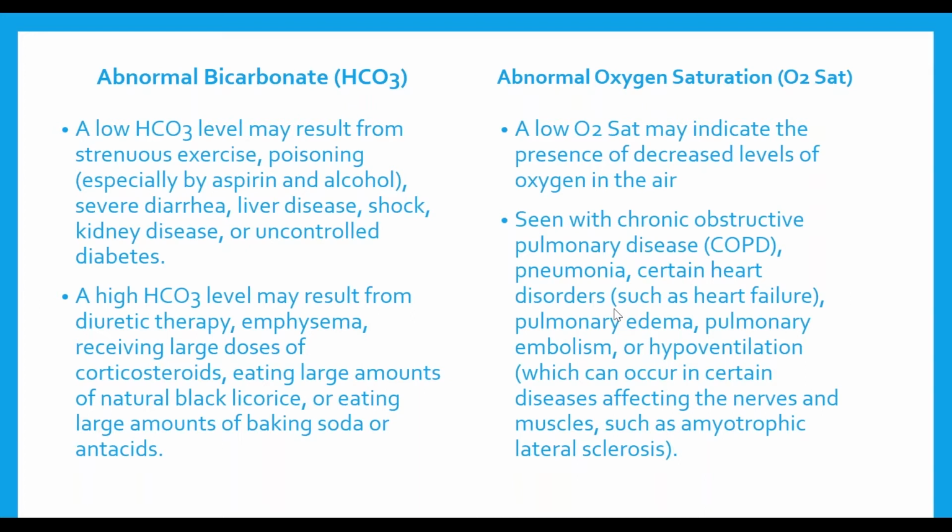They're available in the clinic. A pulse oximeter is usually available to you in a lot of clinical situations. Maybe outpatient ortho, not so much, but other ones, yes. I've even used them for outpatient ortho because if you're looking for a thoracic outlet syndrome where you would feel the pulse get weaker, you'd also see the O2 sat drop in the hand. So that might be easier to look for than keeping your fingers always on that radial artery.